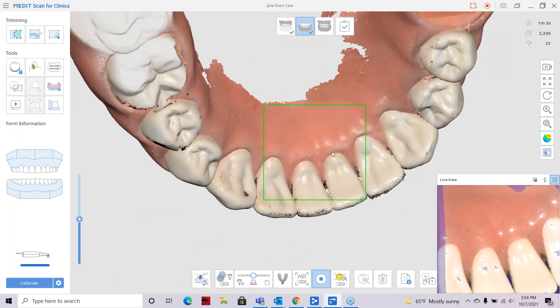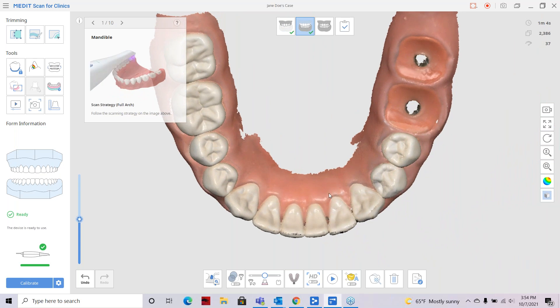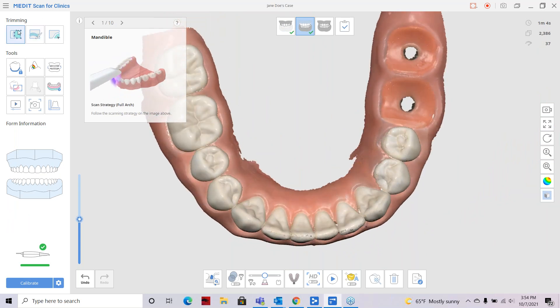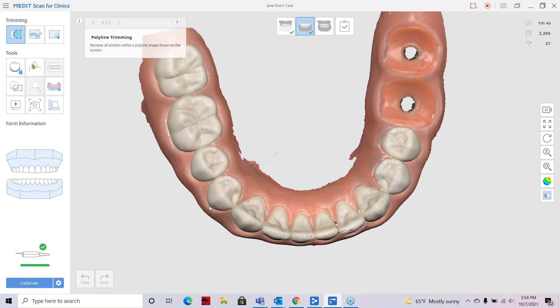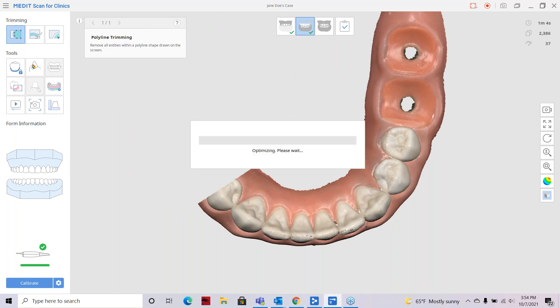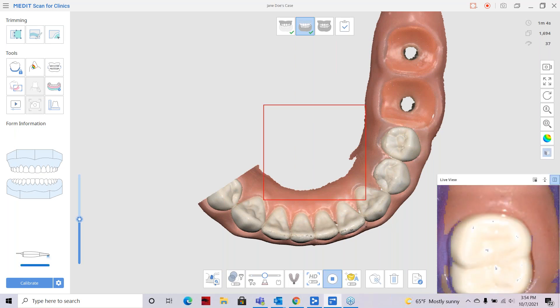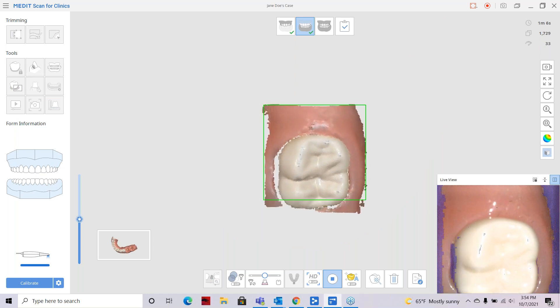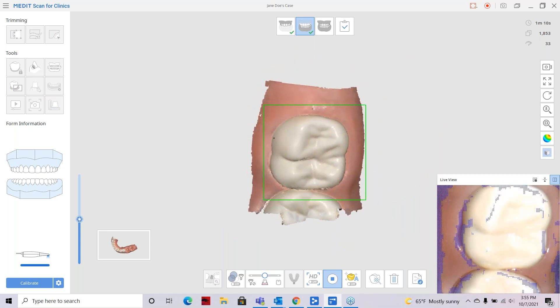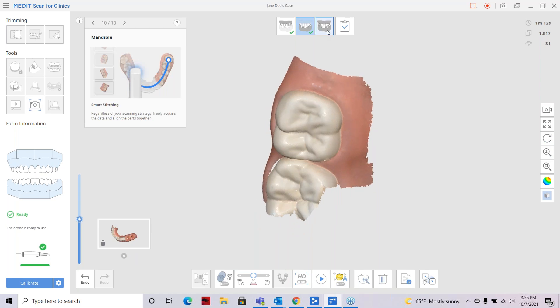This allows the user to hop around in the mouth and still pick up reliable data. I'll stop here, scroll out, and delete part of this scan using one of my trimming tools. Remember: if you forget to click off any of your tools and get back in the patient's mouth, your first blue button click will turn the tool off, and the second click will start the scan. Now I'm going to start on a posterior area rather than where we left off so the thumbnail can be saved there.